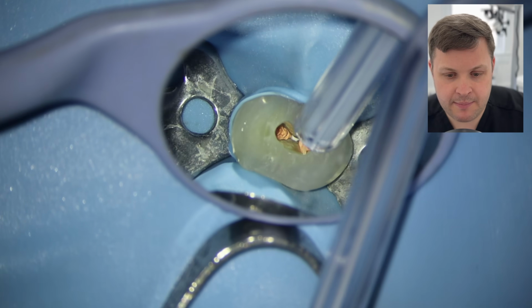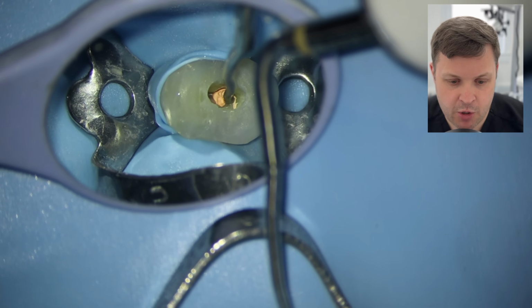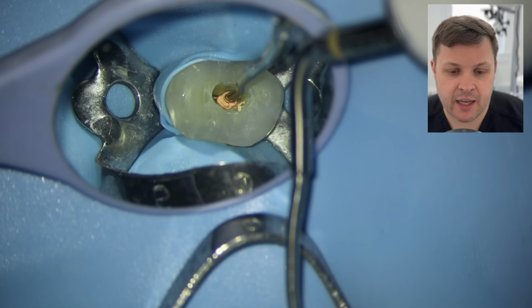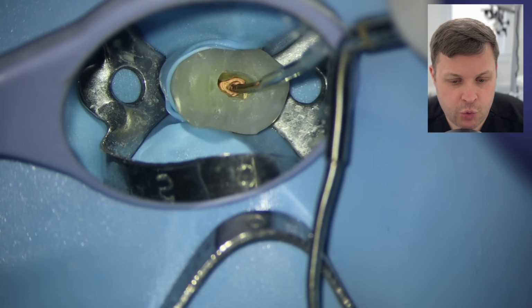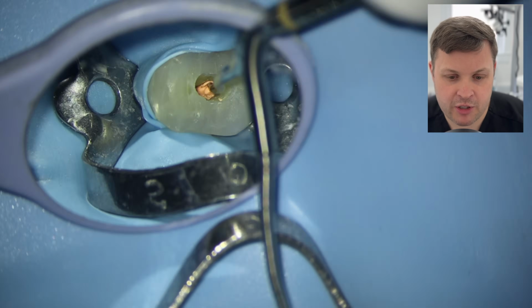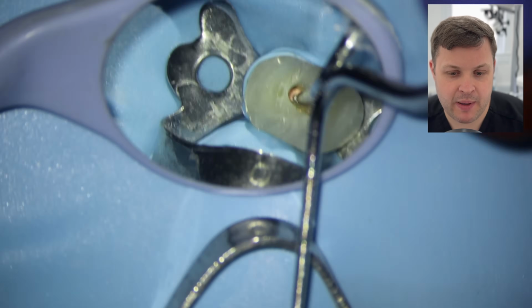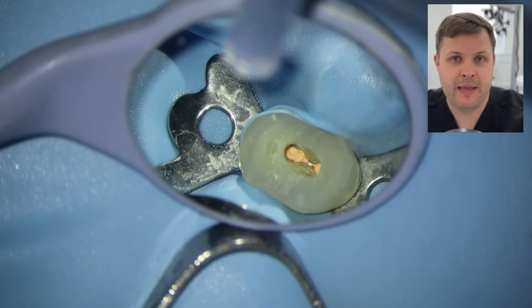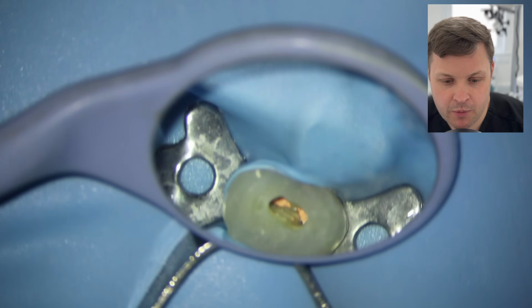And then sometimes what I do need to do is tidy this up, because this doesn't look too great at the moment. So I'm just using a heated plugger to remove 1 or 2 millimeters of the GP away from the coronal aspect. So the GP cones are sitting maybe 1 or 2 millimeters below.